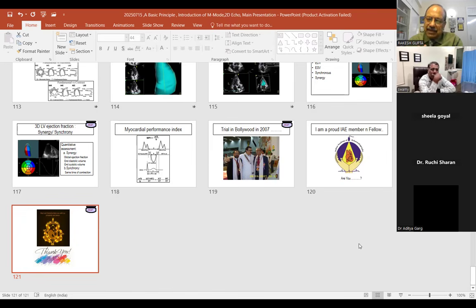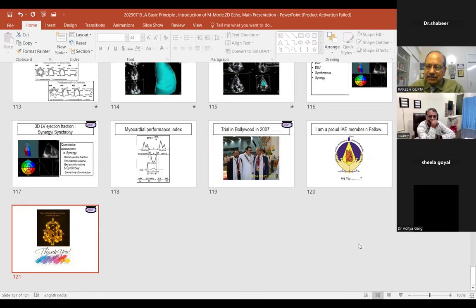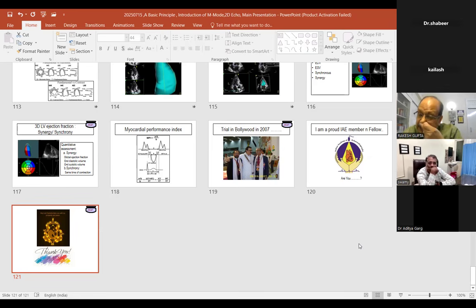Then, if everything is fine, we go to the heart. Look at the IVC, volume deficit. Look at the valves, they are functioning normally. Look at the walls, they are functioning normally. Look at the RV side. If it's dilated, poorly contracting, think of something related to the chest or pulmonary embolism. Coronary artery disease, you can look at using the 16 segment model. If your IVC is normal, everything is normal, then what is the answer? Answer is possibly the patient has septicemia.